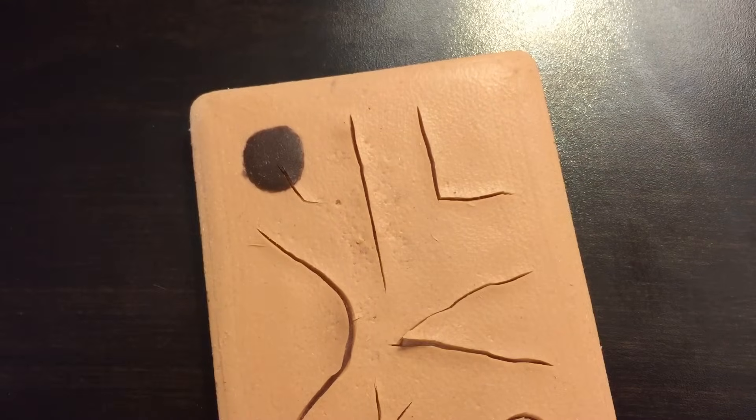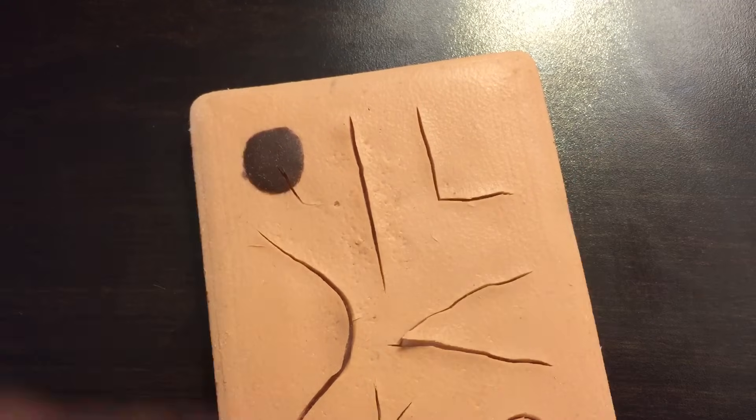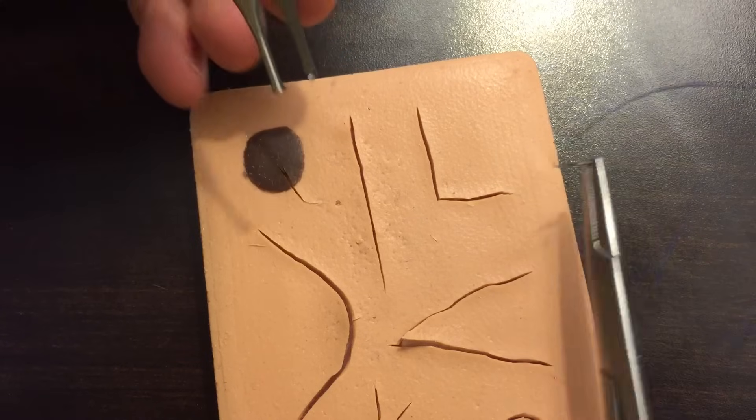In a normal situation — say there's a laceration on someone's thigh that approximates pretty well and is not under a lot of tension — a good simple interrupted suture is a great technique. So let me show you a simple interrupted.